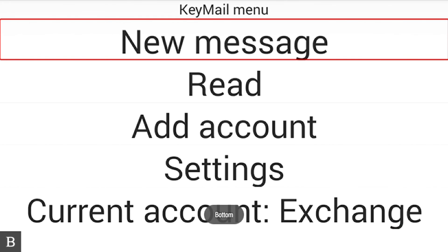I'm going to hit my next thumb key to New Message — I could also have pressed N — and I'm going to activate that by pressing my router key.